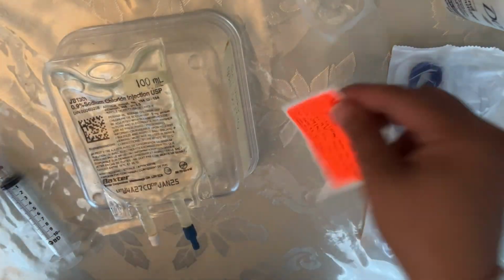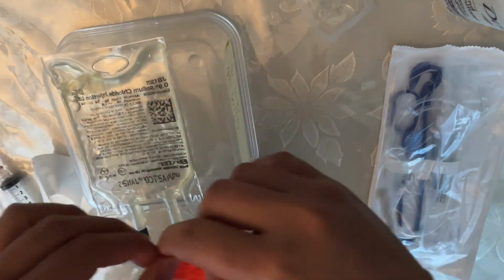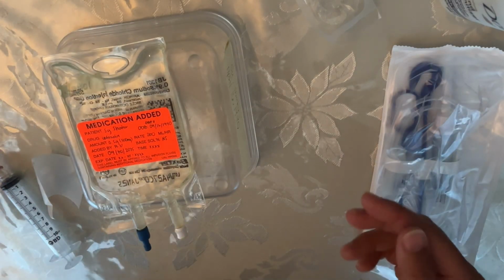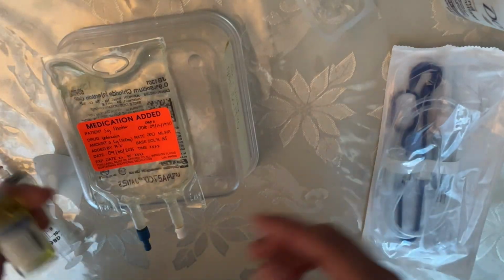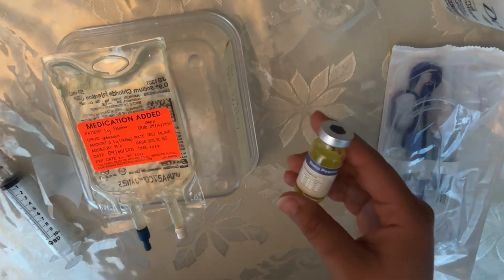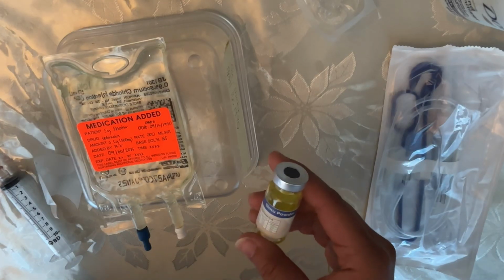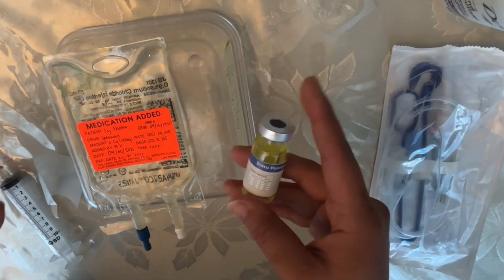Right after, I'm going to take the medication label and stick it on the back side of the medication bag. Before I leave the medication room, I'm going to do the last part of my second check. I'm going to compare my medication container, MAR, and the medication that I prepared. Make sure that I have the right medication and I follow the medication IV administration instruction, and also check my medication label against the MAR and the medication container.